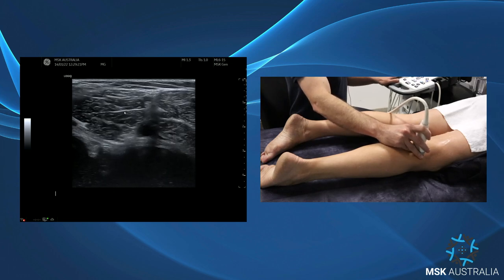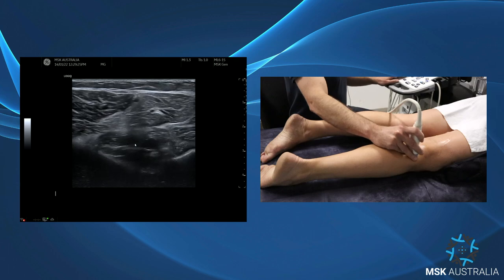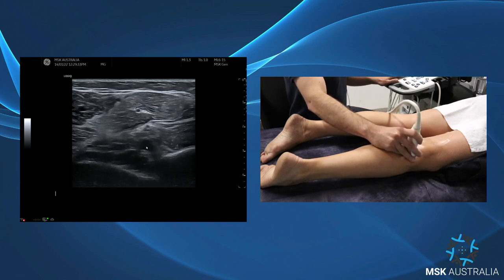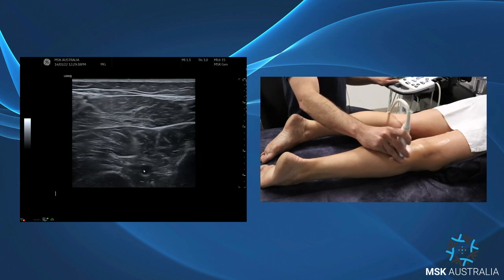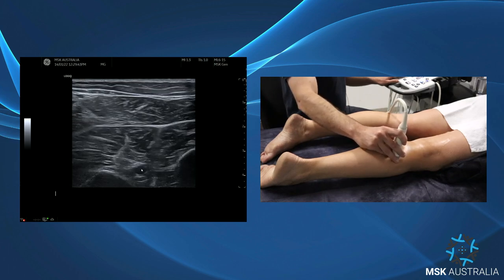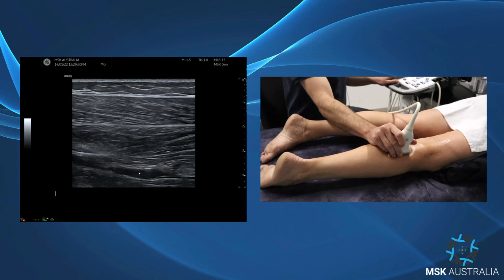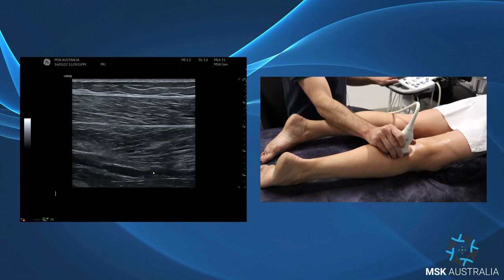So we have medial and lateral gastroc, and as we come down we have popliteus coming in under our artery with the lateral and medial gastroc over the top. Coming down further, the distal end of the popliteal artery is the tibial peroneal trunk and the anterior tibial artery coming off there. We can see those quite easily along where the artery comes down — just where it flattens out, that's your tibial peroneal trunk.